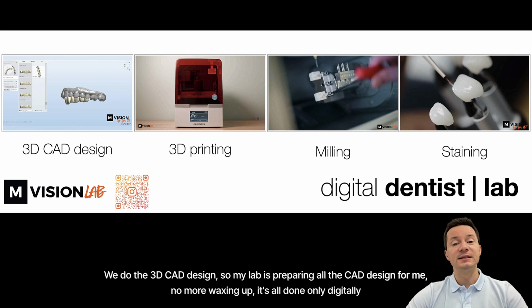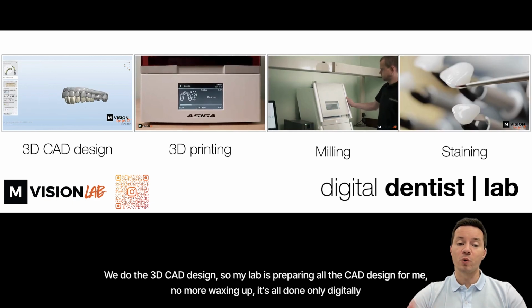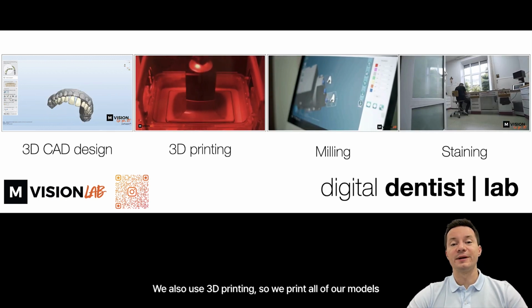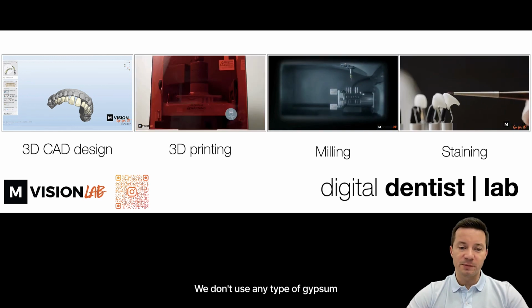We do the 3D CAD design. So my lab is preparing all the CAD design for me. No more waxing up. It's all done only digitally. Then we also use 3D printing. So we print all of our models. We don't use any type of gypsum anymore.